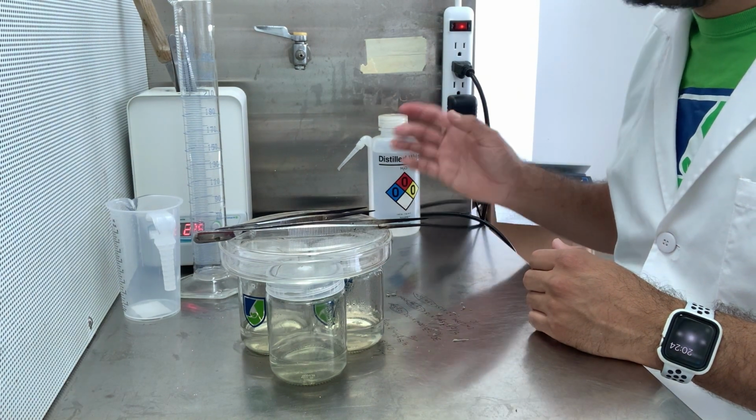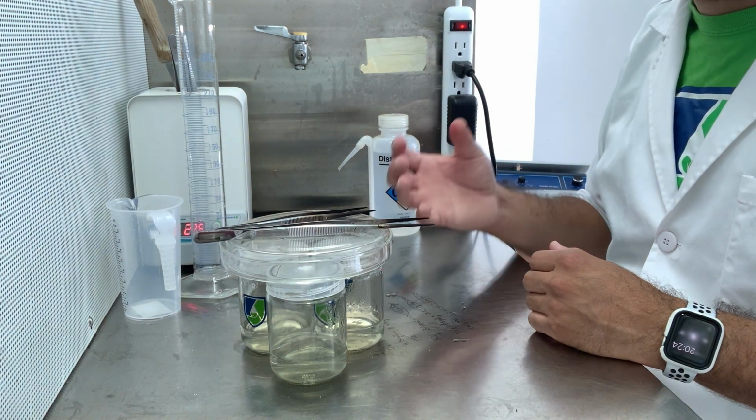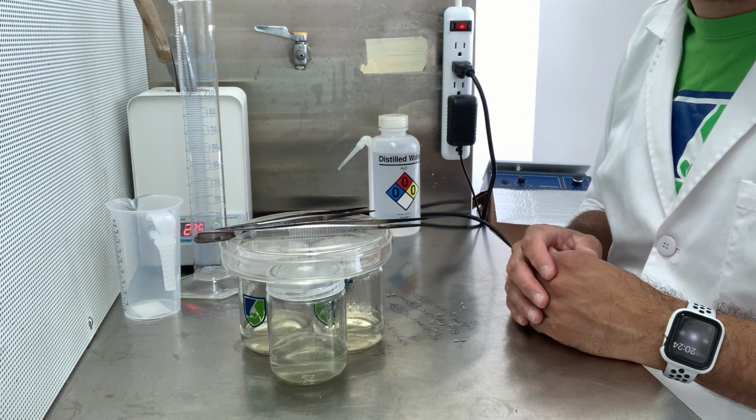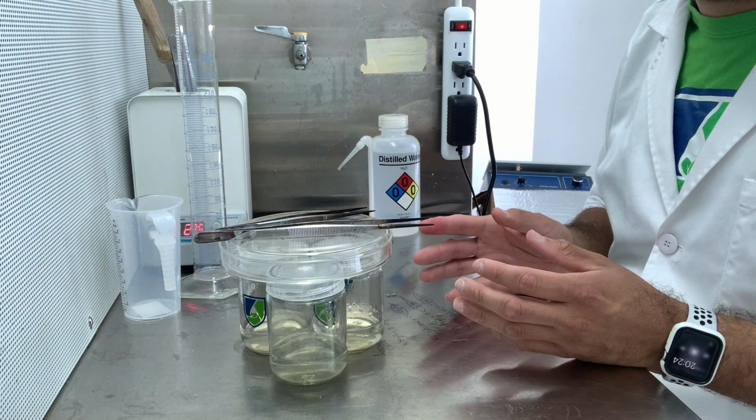Oh, as well, make sure to put a flask of sterile water if you're going to use bleach to sterilize your explants.